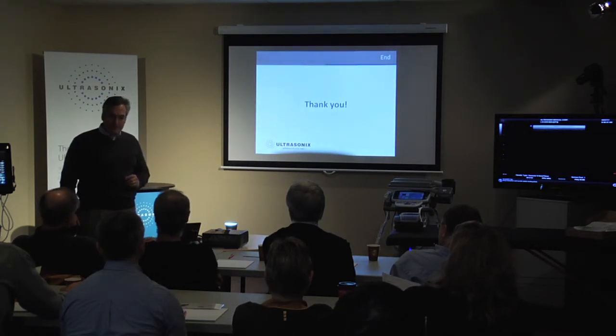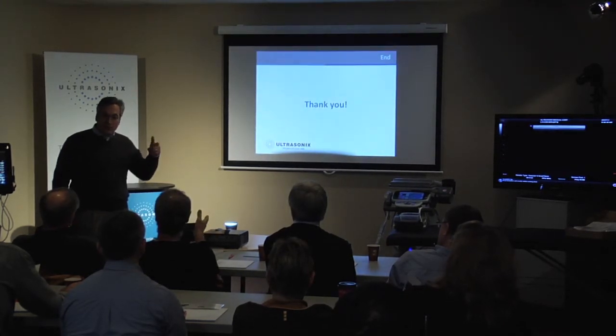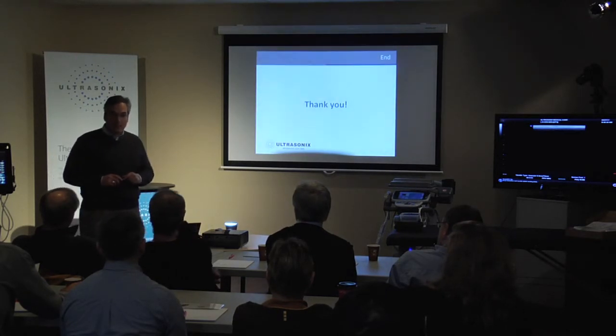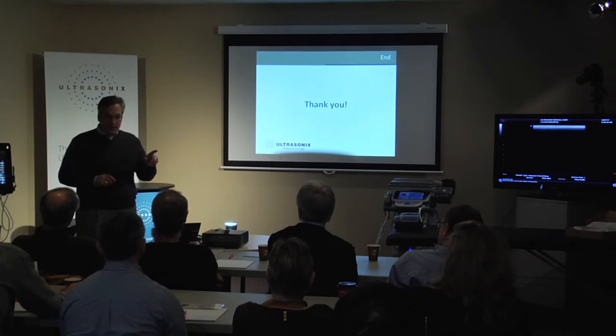But more importantly, my colleague's been using the machine just before me and fine-tuned everything, and I come along and do another study. The machine's been shut off, or not shut off, I don't know. I turn it back on again. Is everything preset to a certain factory setting? The system will remember the previous settings that it was in. So if he screwed it up for me, then I have to go and readjust everything to my visual desire.